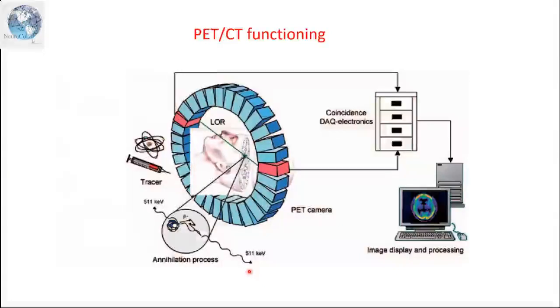PET functioning, like I mentioned, we can image many body parts. We can do a whole body scan by doing it part by part. Even now, there's a new scanner with multi-detectors that can image the whole body in 8 minutes. Okay, I know United Imaging might be talking about that later. So there are many advances in technology.